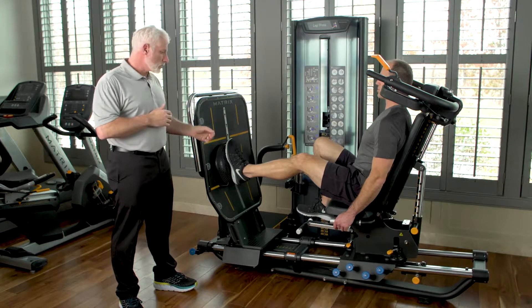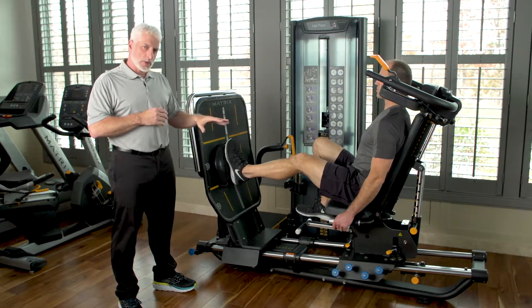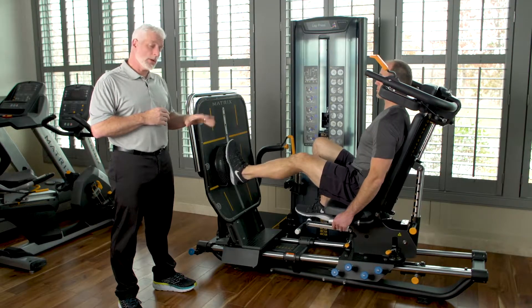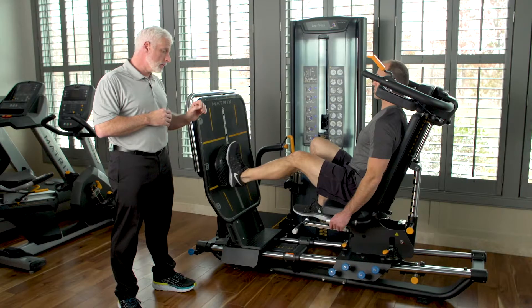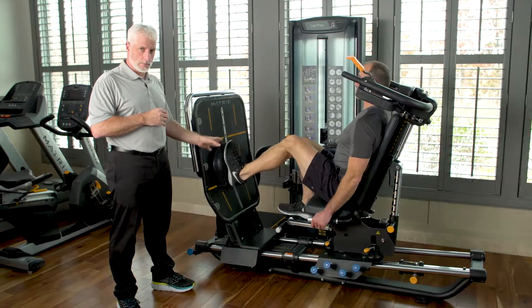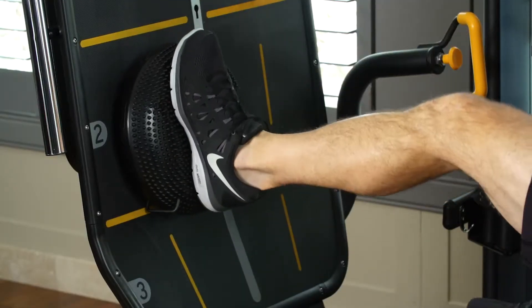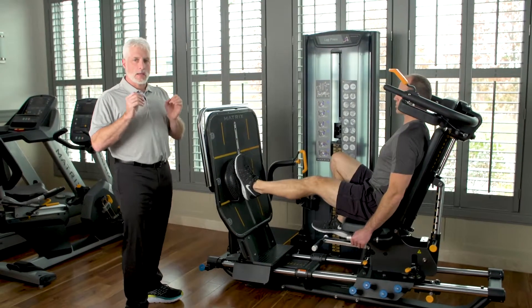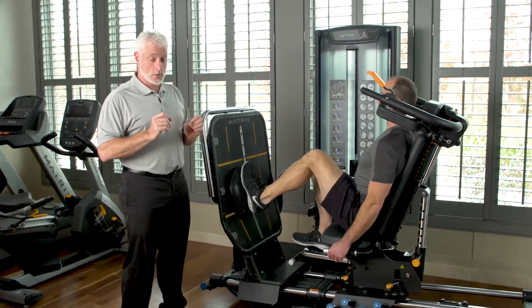As we're doing this, we can do flexion-extension — just basic dorsiflexion and plantar flexion with the ankle. Then we can bend the knee at the same time, so we engage the quads and engage the foot. As he's doing that, he's engaging the ankle, foot, and all the intrinsic muscles in the foot as well.